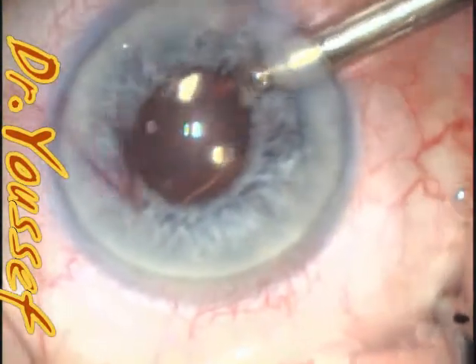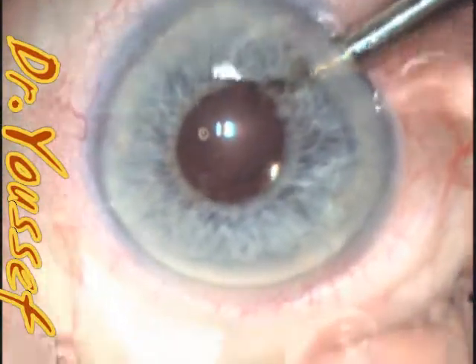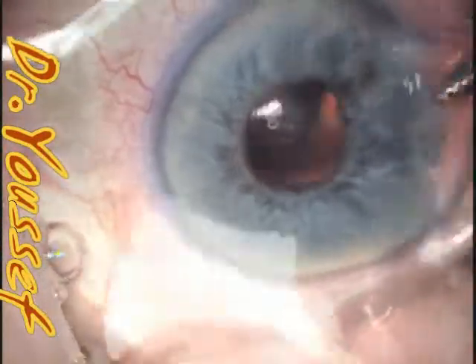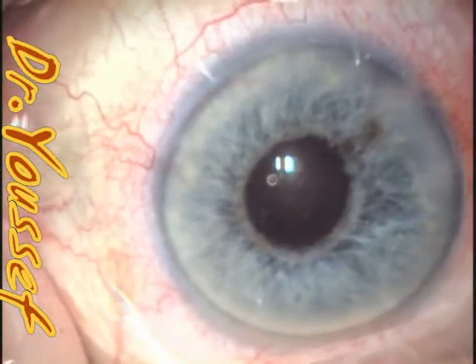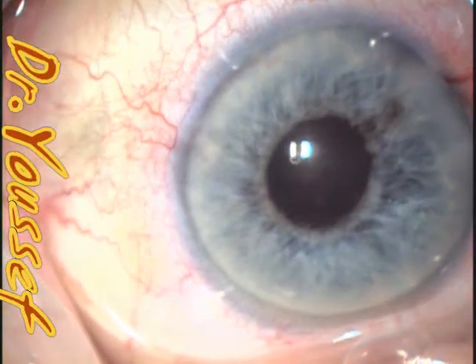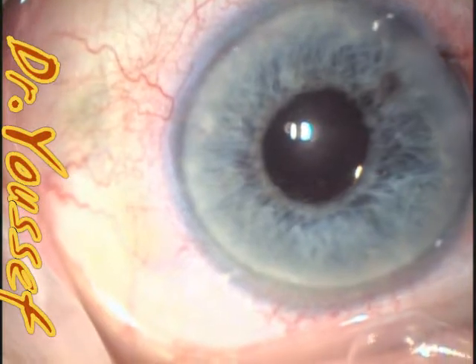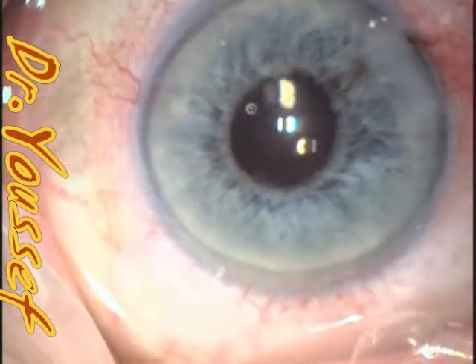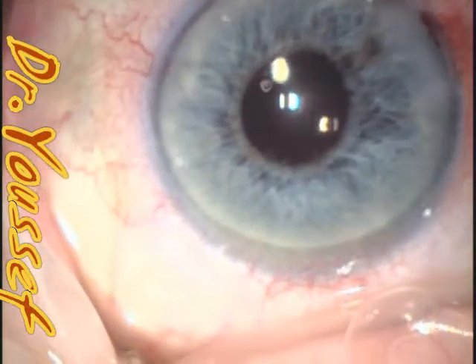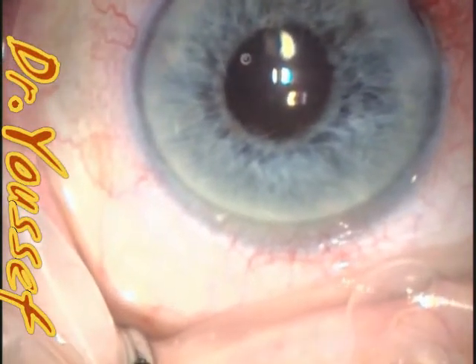Now I'll do the irrigation aspiration cautiously. But here I can see a small amount of vitreous fibers. So I'll do a little bit of anterior vitrectomy, just to be on the safe side, because there's a small amount. If you're in doubt that there are vitreous fibers, you can't do irrigation aspiration. You have to use the vitreous cutter to remove it.